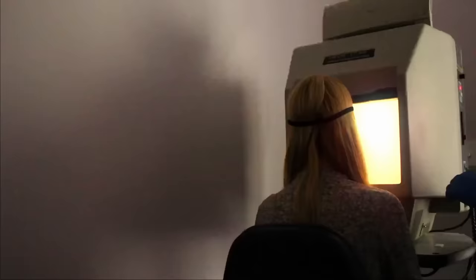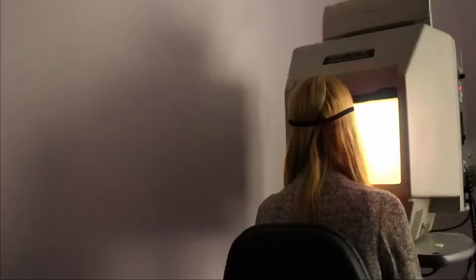One. You're doing great. One. One, two, three. Follow the red light. One, two, three. Follow the red light. One. You're doing well. You're almost finished. Exam complete. Right, take a seat for me.